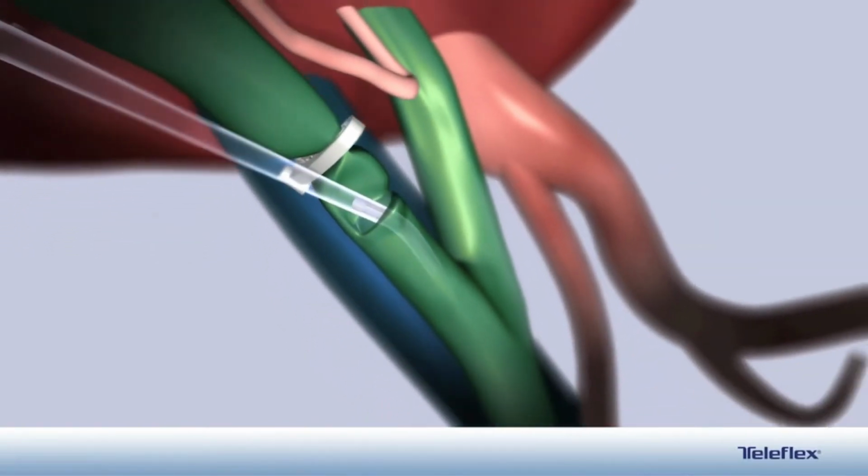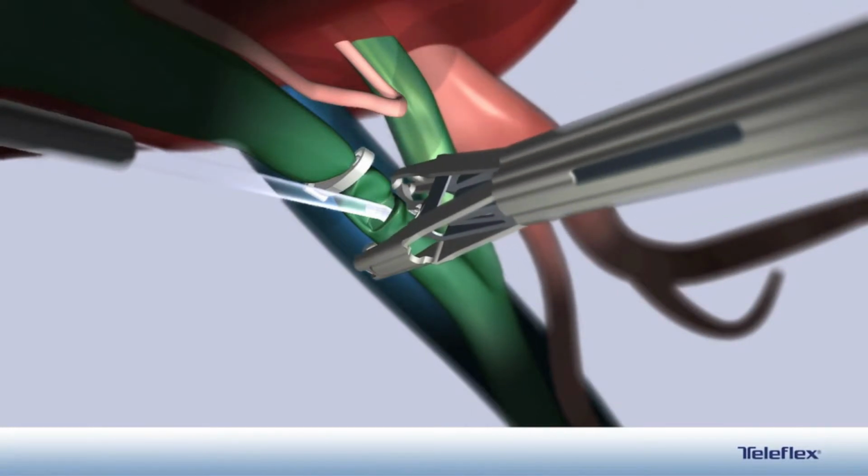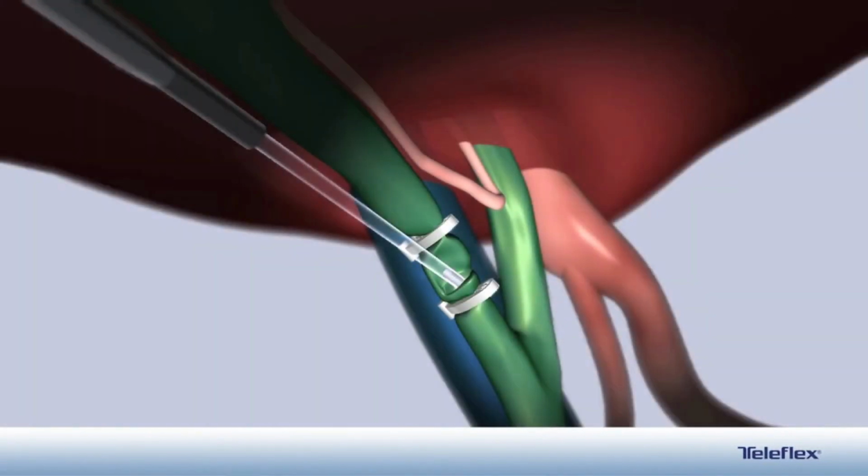Clear visualization of the clip around the structure prior to clamping is key to achieving a secure lock across the structure. Once the cholangiogram is completed, leave the clip in place and remove the catheter. Note: the barrel of the 18400 allows smooth removal with the Hem-o-lok clip in place.